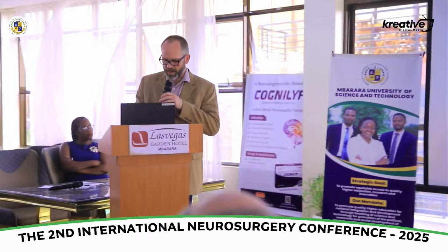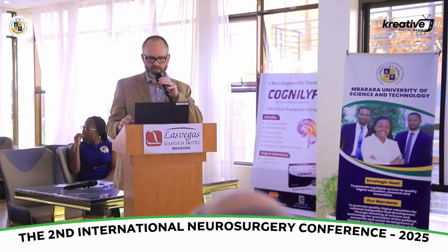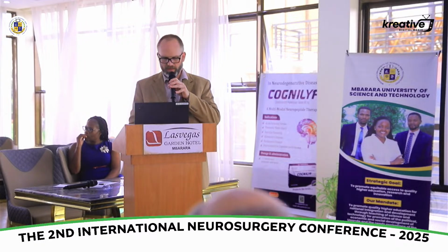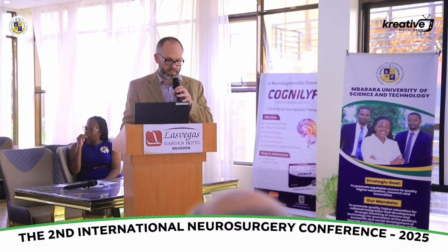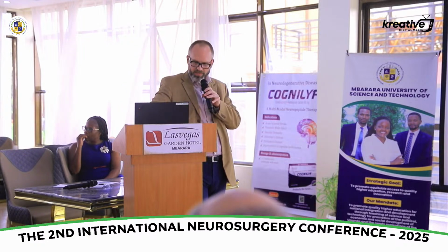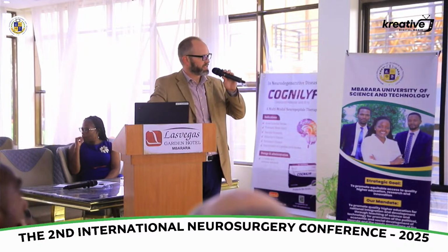And on the coronal view, you get 5 images. This just shows one side, but there's 2 others on the contralateral side that are picked up. And this has all been standardized. Transducer obtains an image through the frontal lobes. We've talked about this. This is what this looks like. And you can see this is quite different.